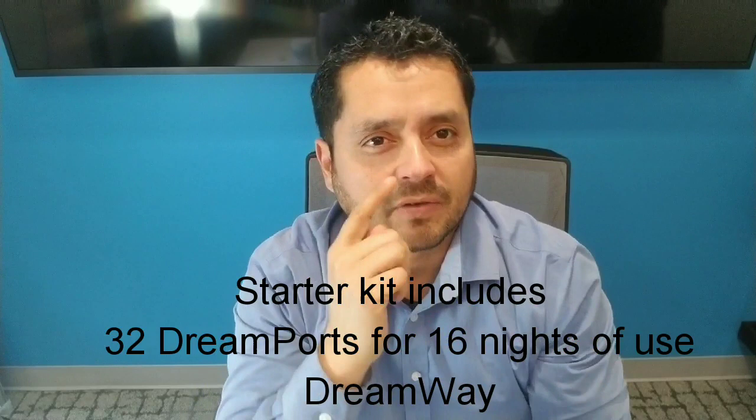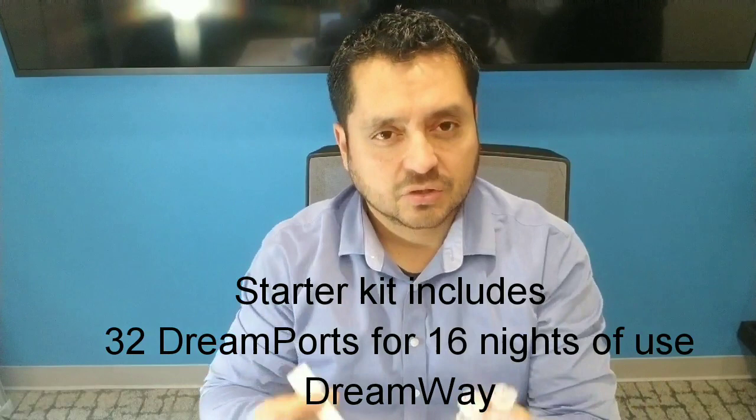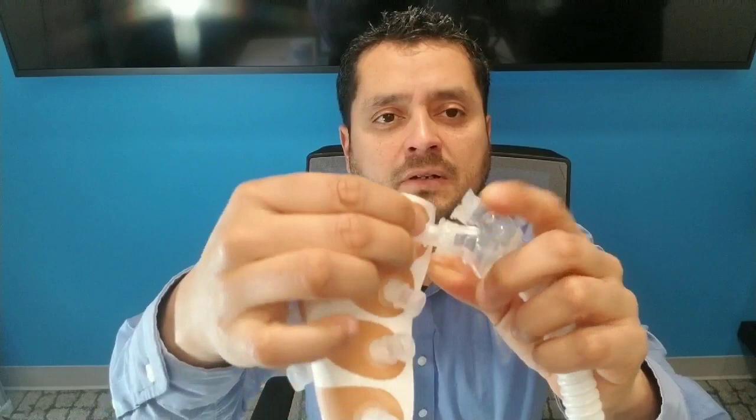What's the Dreamport? These are Dreamports right here. These pieces do not go in your nose. The adhesive is going to get peeled off, it's going to wrap around the nostril, and it's going to get connected to the Dreamway. There are clips here which are going to snap right in.